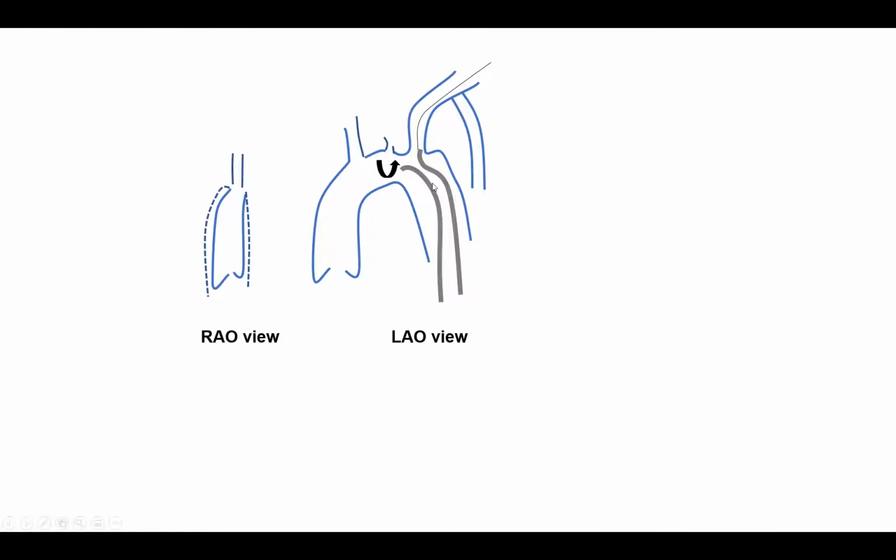Okay. I want you to know this idea. It may seem that if you take a catheter and put it outside the body and clockwise torque it 180 degrees, or counterclockwise torque it 180 degrees, the catheter will reach the same point. You will end up reaching the same point, whether you go counterclock or clockwise. That's not true inside the body. In a three-dimensional view, across the tortuosity of the arterial system of the body, 180 degrees counterclock of a catheter will point it totally differently than 180 degrees clockwise torque of the catheter.